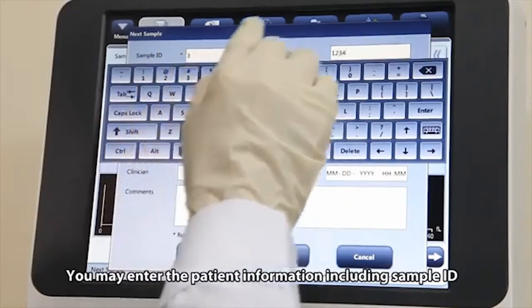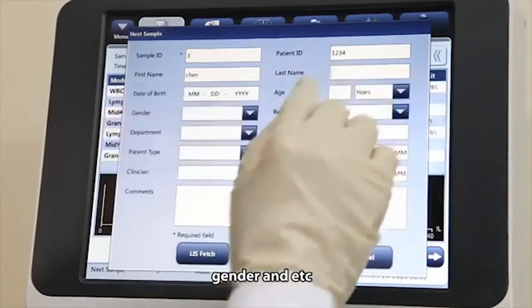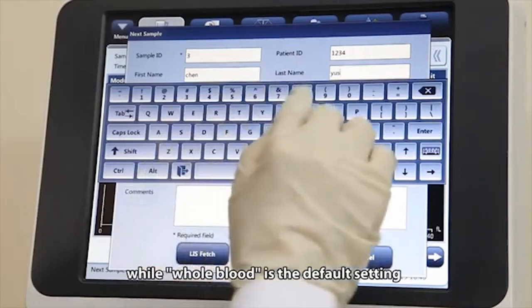You may enter the patient information, including sample ID, name, age, gender, and etc., while whole blood is the default setting.